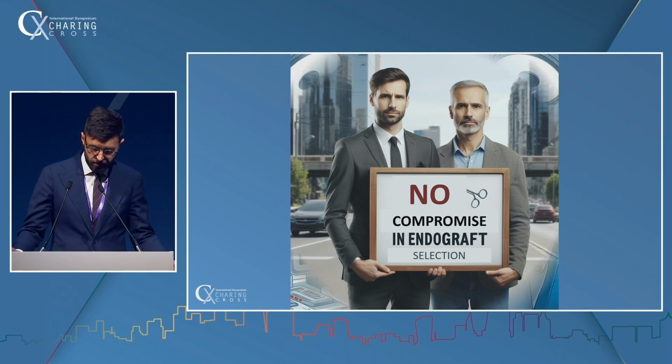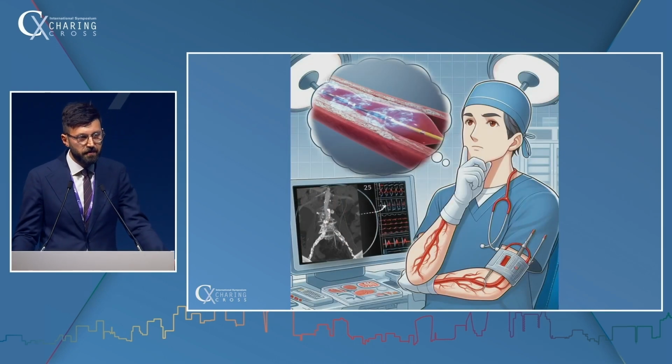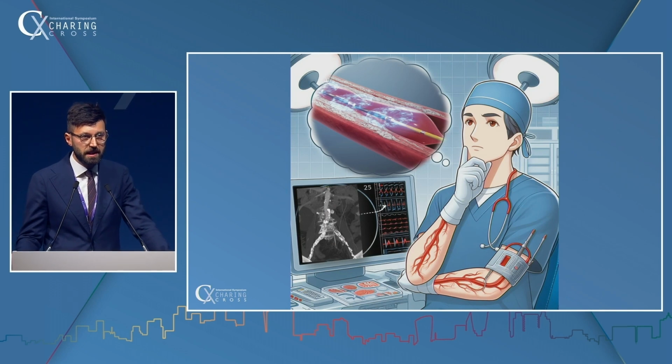when you see calcium in your vascular axes, think IVL as a first-line strategy for our patient.